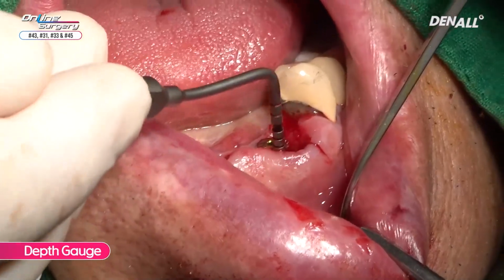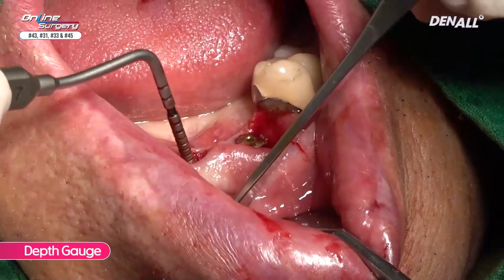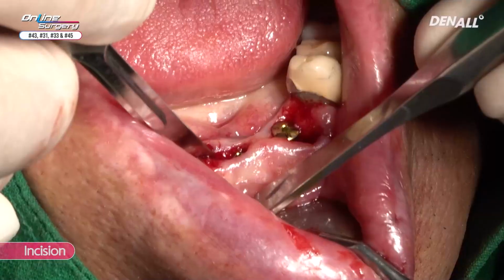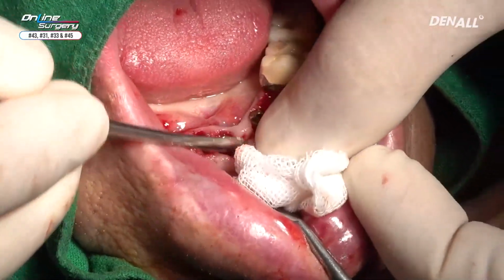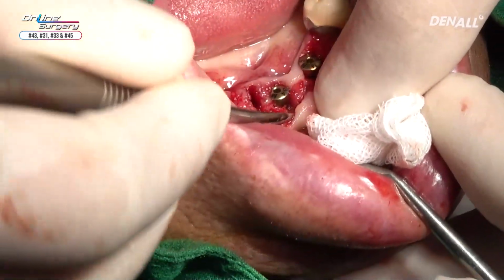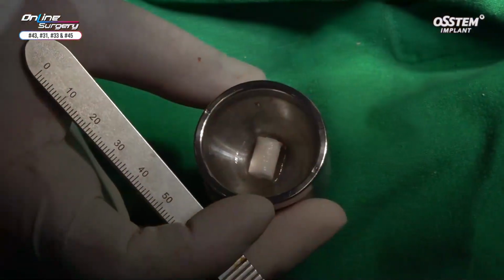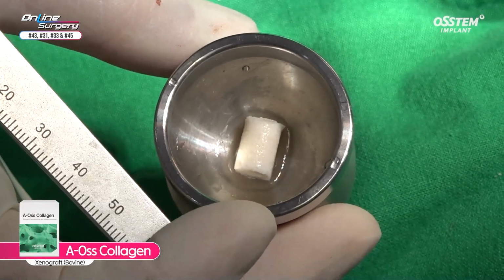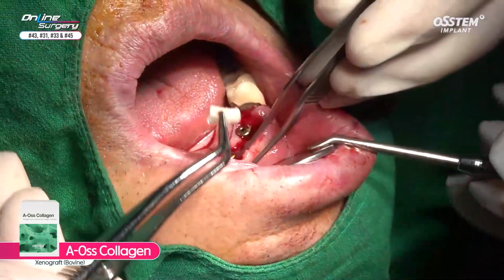So on here, because there were two roots, I'm going to do bone graft on the buccal side. Thread is not exposed. A Oss Collagen is bovine bone. Collagen is 10% and bone is 90%. The particle is going to be placed.